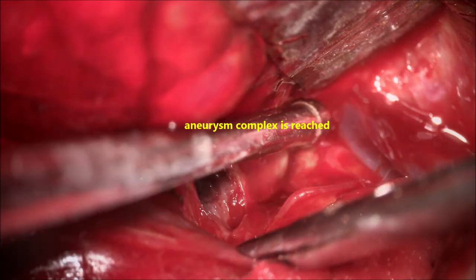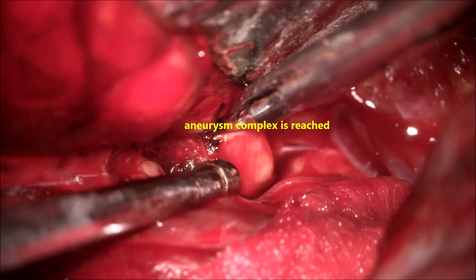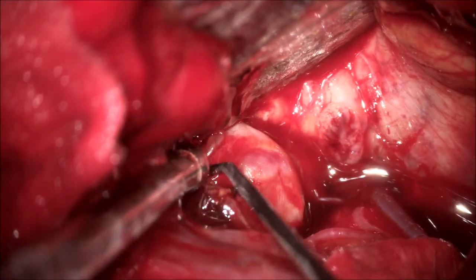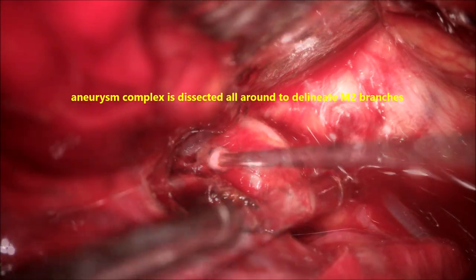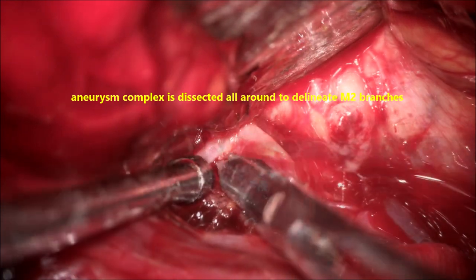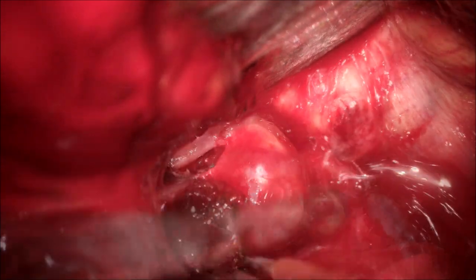All dissection should be done under high illumination and high magnification. No vein or artery during the Sylvian fissure dissection should be damaged. Take your time, gently dissect, and keep washing at every stage to clear blood from the field. We have now reached the aneurysm complex. The dome of the aneurysm is visible, and the superior surface appears to be the area of rupture that caused the hematoma and subarachnoid hemorrhage.